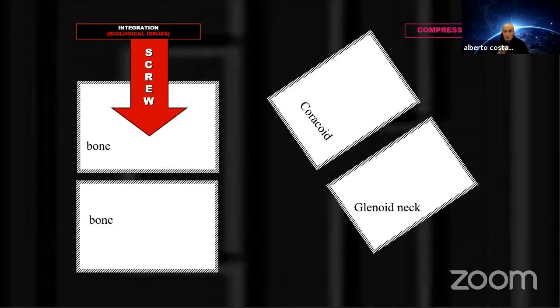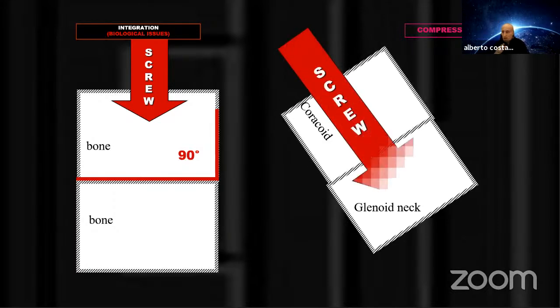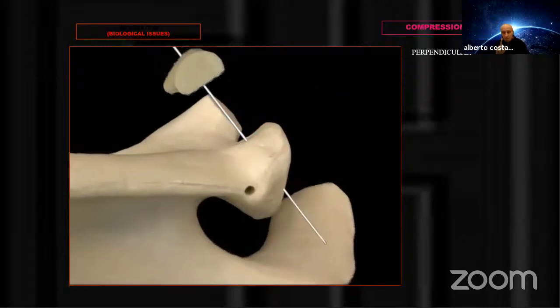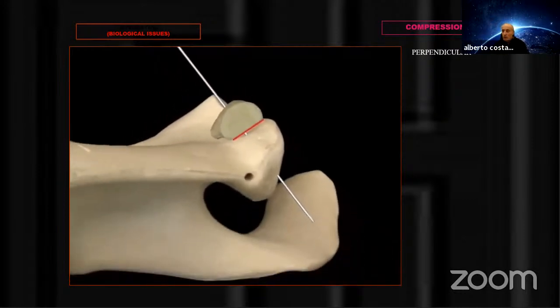We know that if we put the screw perpendicular on the bone, we have good contact with good stability. But the problem in the shoulder is that if we go parallel, 90 degrees, perpendicular, we may have the protrusion of the screw inside the joint. So this is a big issue for this kind of surgery.